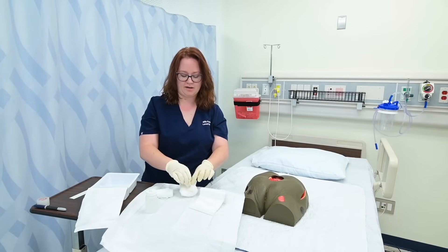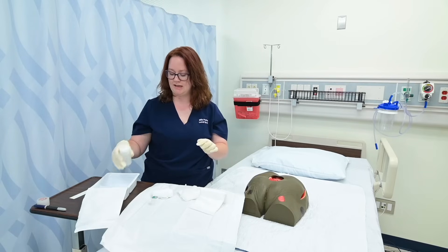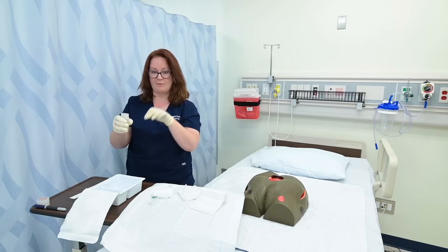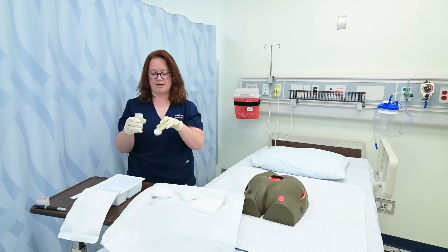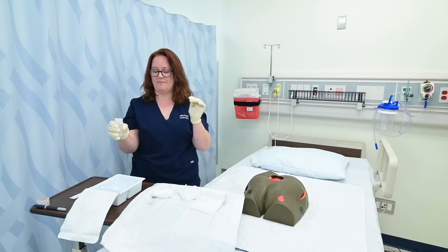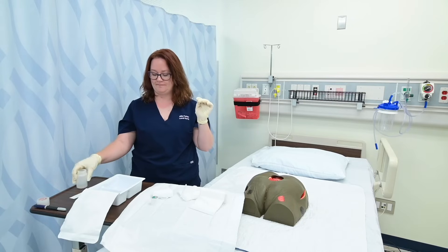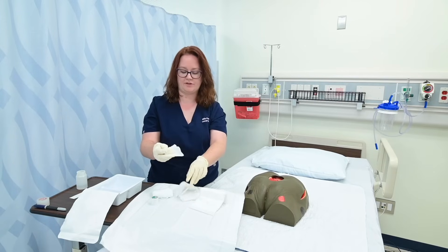I'm going to go ahead and open my sterile gauze and pour some of this sterile saline into my sterile container. I'm going to unscrew my lid and throw it away because I'm going to use this as a one-time use. If I wanted to use it again, I could place it with the open side up on a surface. Not dropping my hand below my waist, I'm going to palm the label and pour some of the saline into my container. I'm going to use that saline with this gauze to clean my wound — that's the first step.